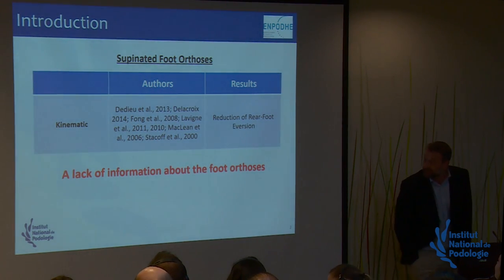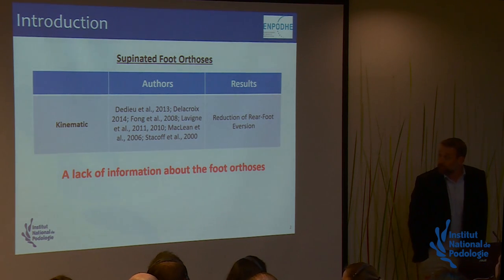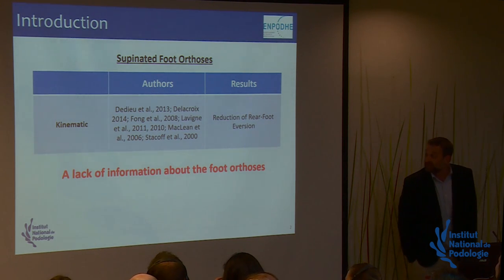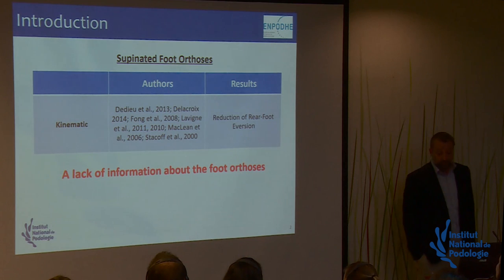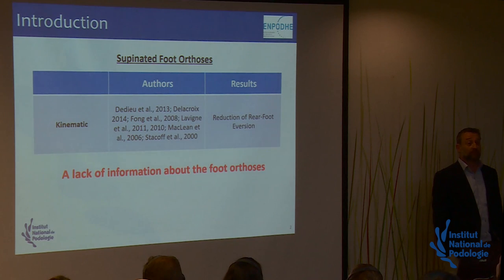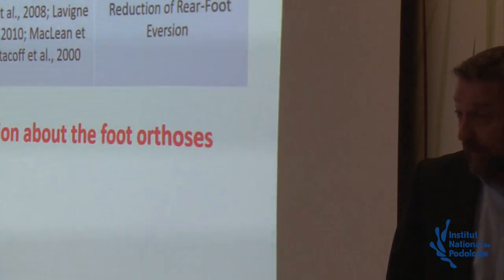Well, what says the literature? The literature says that supinated foot orthosis reduce a rear foot eversion. The problem is that in all the studies I read, there is a lack of information about the foot orthosis. It means we have no information about the elements which are on these orthoses. We don't know the hardness of the material which is used on these foot orthoses. So we don't know how they are made and what is the slope necessary to reduce an ankle eversion.